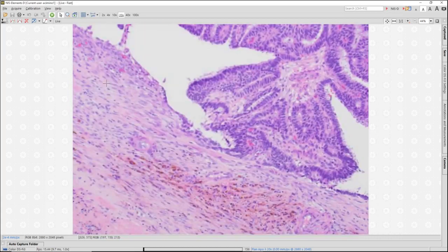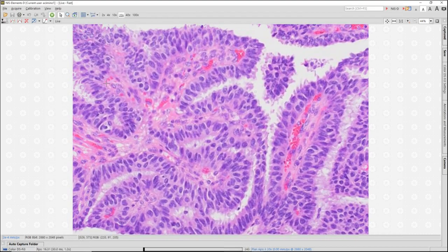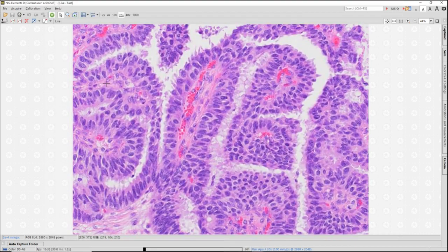When I look with my eyes, without using immunostains, just at the H&E, I want to ask myself, do I see myoepithelial cells in this core? I don't definitely see myoepithelial cells. I see a nice capillary, the supportive cells in the fibrovascular core, and then I see these lining cells, which are hyperchromatic and somewhat columnar in orientation here.